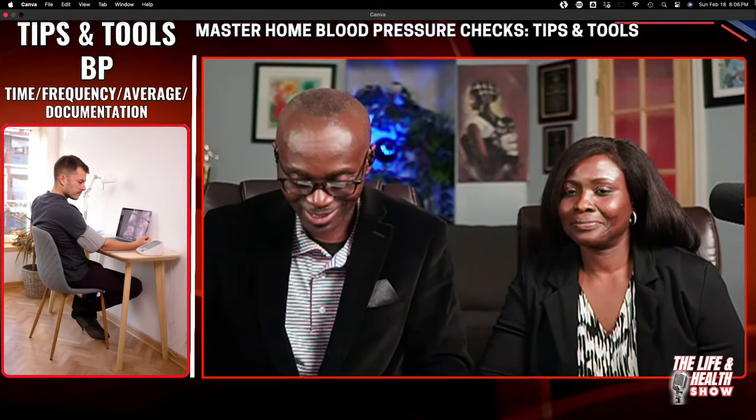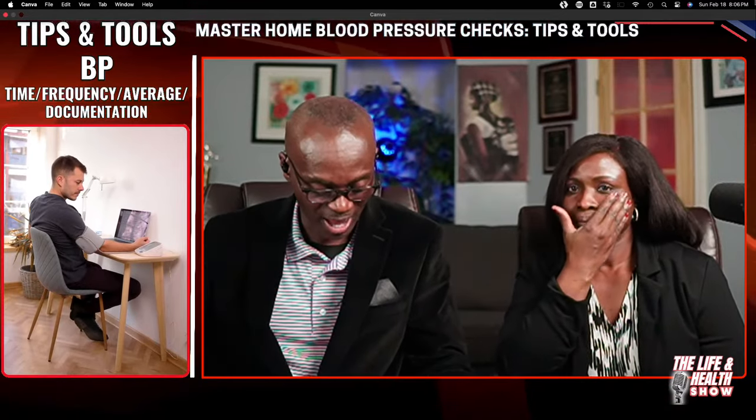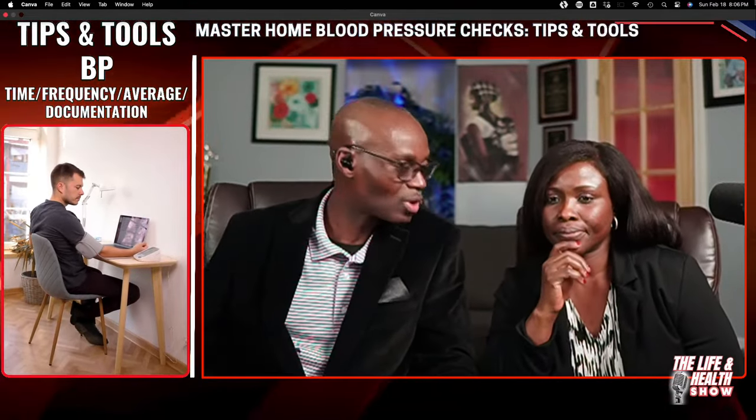But if you leave it on a machine, before you know, you forgot. The machine turns off and you forgot. You wrote it down, you see the paper again. Hey, this thing is 160. This thing is 150. I got to do something. Yes. You will definitely be reminded to do something about it. So I think the documentation, though the machine can take it for you, I would still write it just to speak to you. Because numbers speak louder than words, right? Pictures speak louder. All right. So I think that is some of the tools and tips. Do you have any other tips?